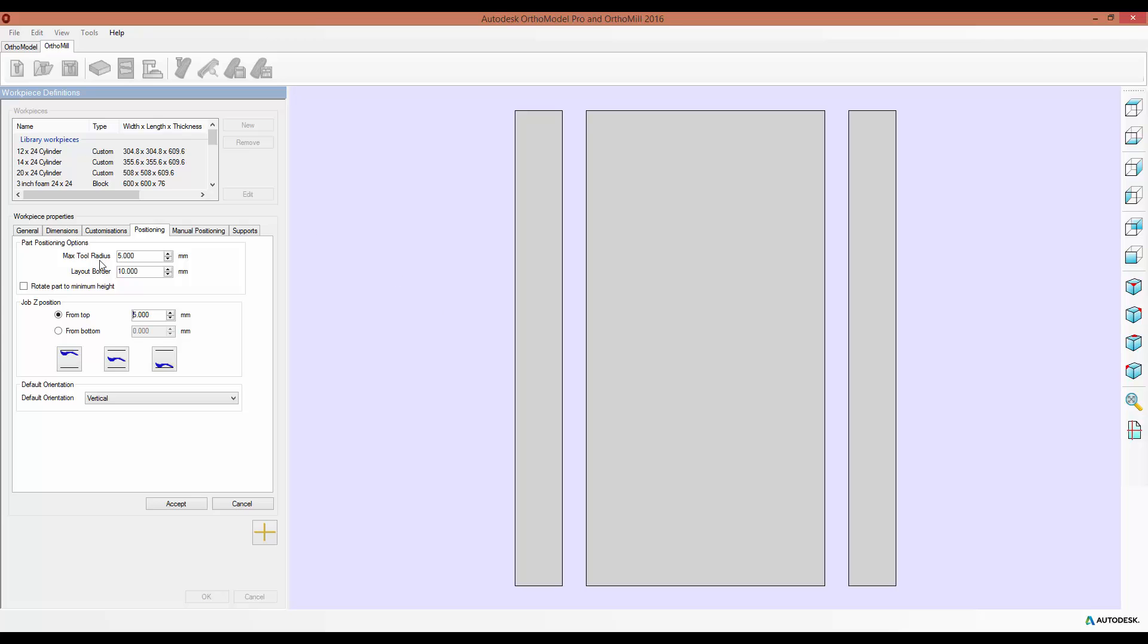In this Part Positioning Options section, you can set the maximum tool radius that you can use, so the white boundary that appears around your part, and also the layout border, so the boundary around each part, dictating how far away each part can be from another one or from the edge of the workpiece. And then also switch between a vertical or horizontal orientation.